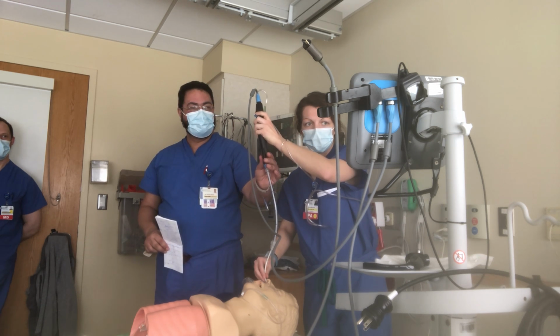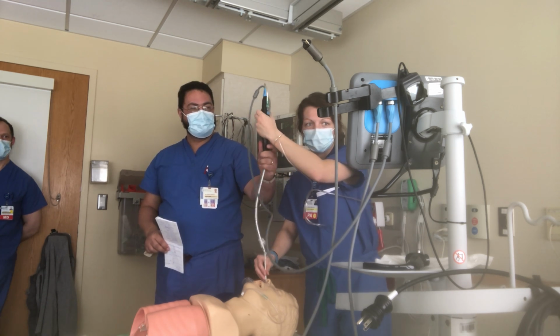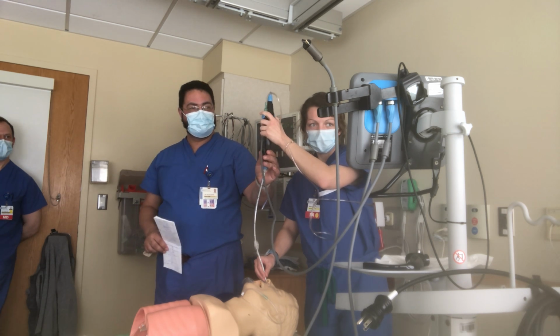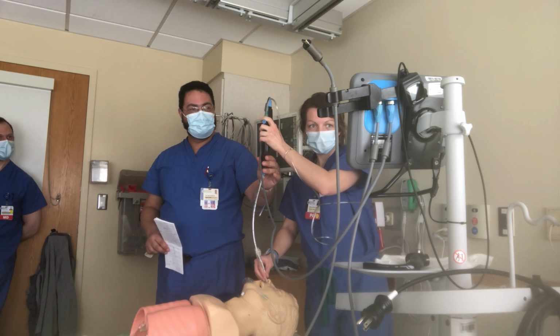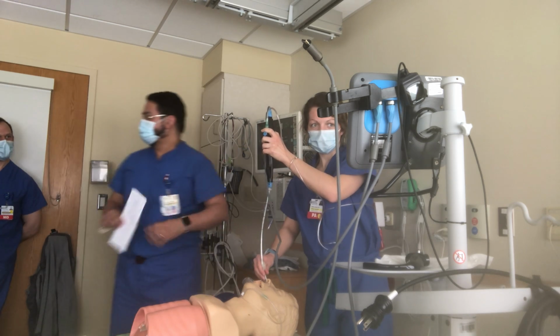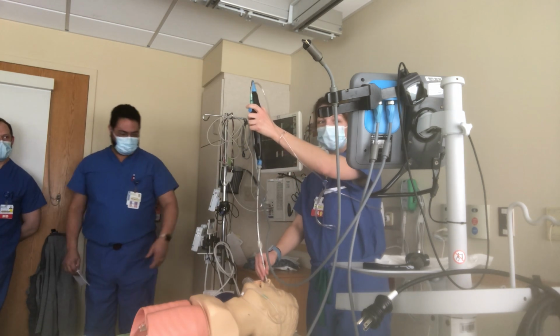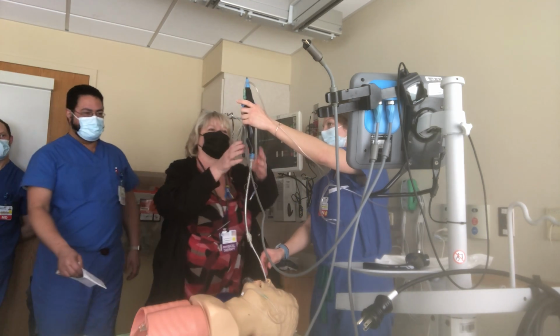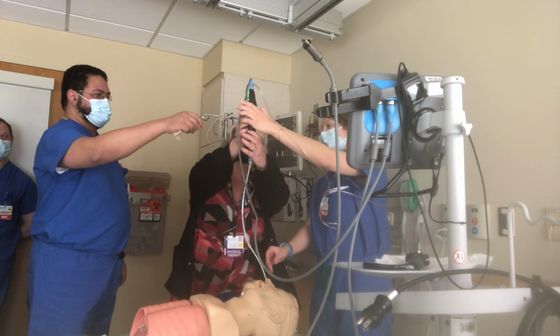I think he has a tumor. Yeah, yes. You're upside down, madam. You can intubate upside down. It's not completely. Right, Nancy. Oh, are you kidding me? Here, I'll leave it in the nose. I'm terrified of this. Well, I'm not gonna kill this guy. Okay, it's time to go.